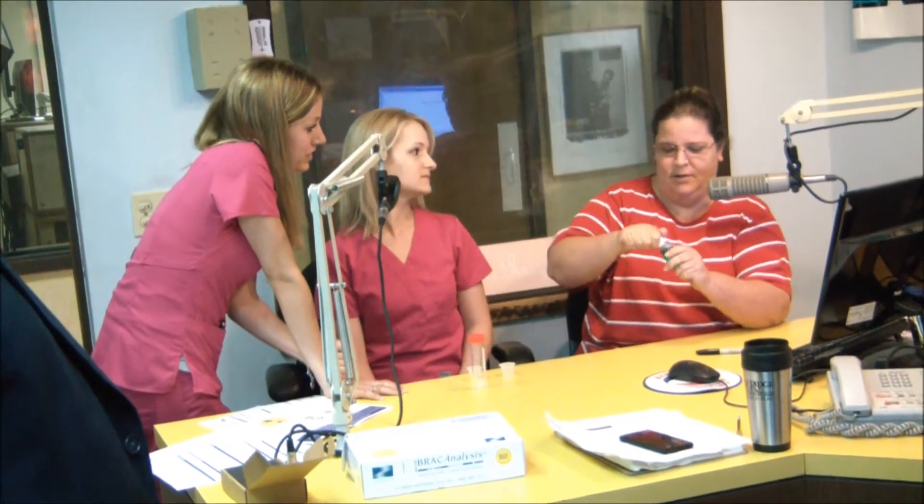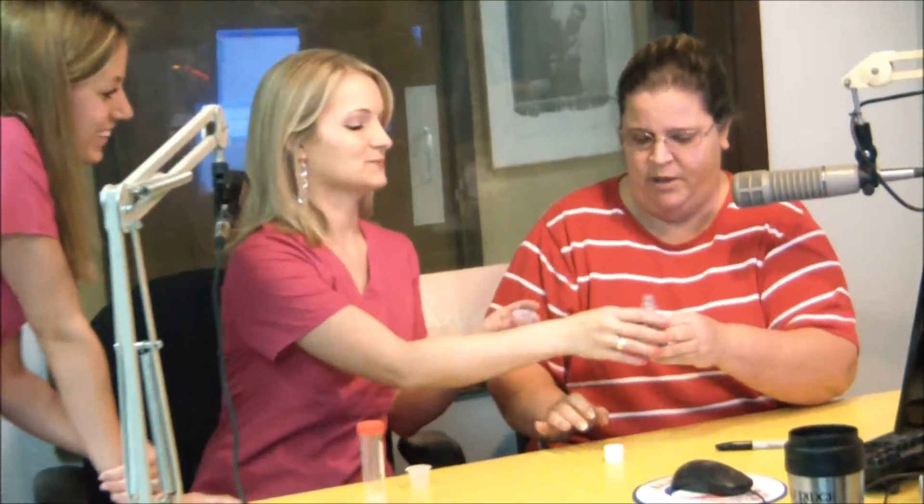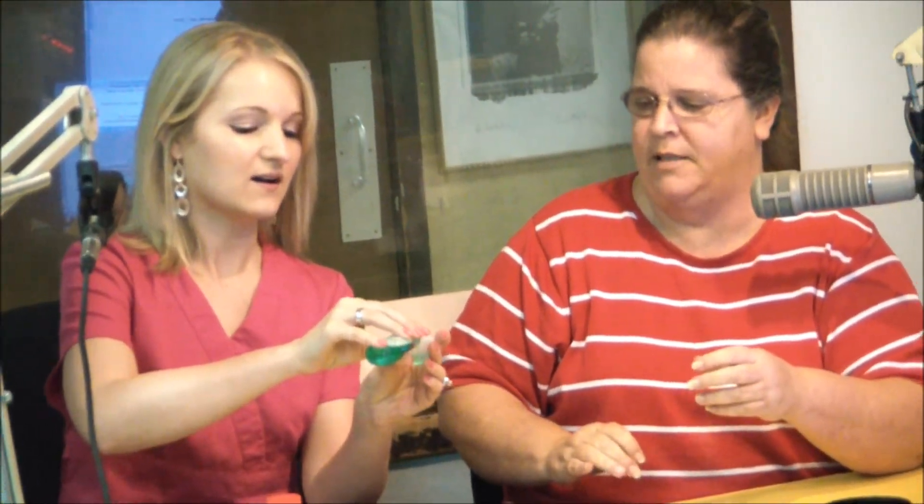You'll have to take the Scope in your mouth and you'll have to swish it around for 30 seconds. Swish for 30 seconds. How much Scope? Just this little cup right here. Oh, that's easy enough.